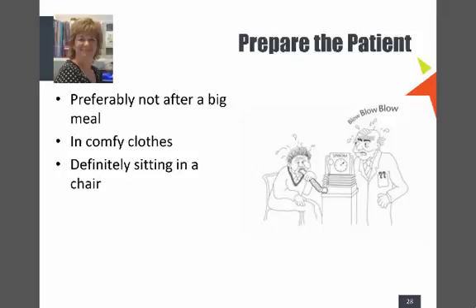Okay. So preparing the patient, as we've already said, no meds, preferably not after a big meal, just to make it more comfortable in comfy clothes, and definitely sitting on a chair. Don't allow anyone to con you into doing it standing up. I've done it myself and had them slide down the wall. Don't do it.